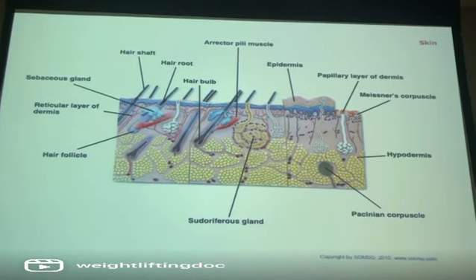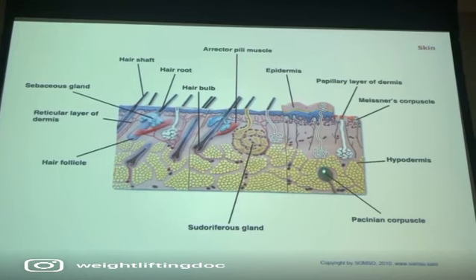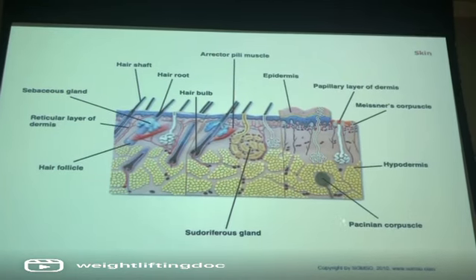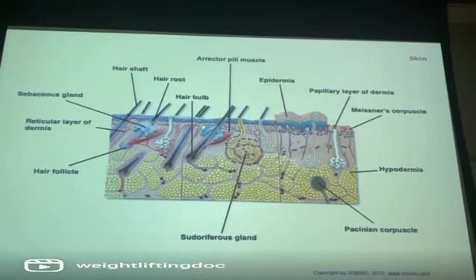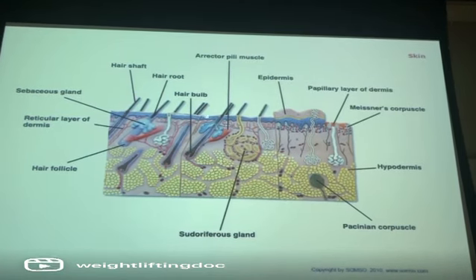It's actually subcutaneous. There's a receptor right here. Looks almost like we cut an onion again, an onion that's cross-sected, and it's called a Pacinian corpuscle. P, think P for pressure. This is a deep pressure receptor. We have some other structures here. By the way, this is thin skin on this side, so you don't see that extra stratum lucidum on this side of the model.